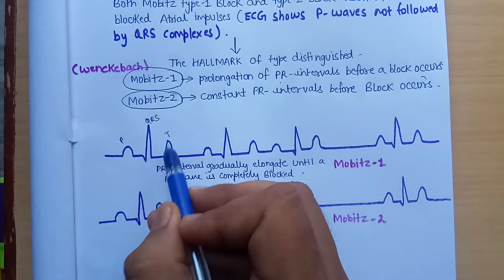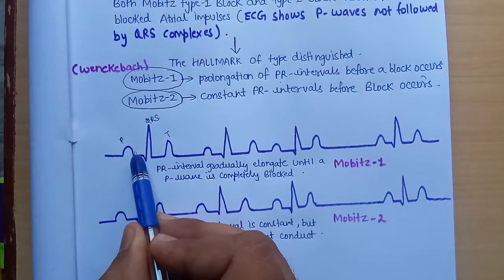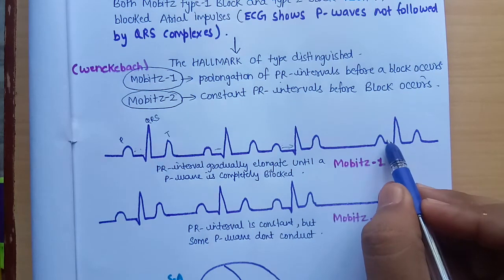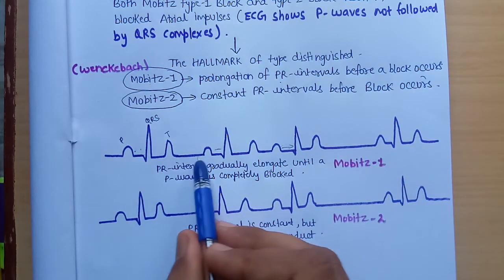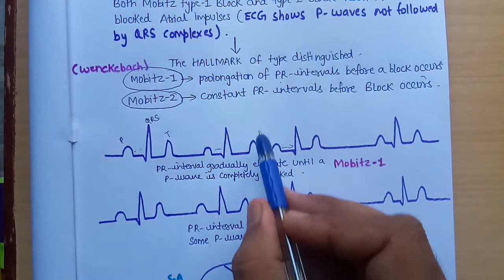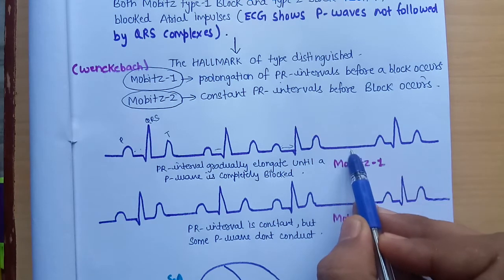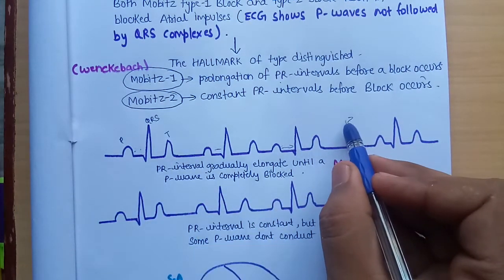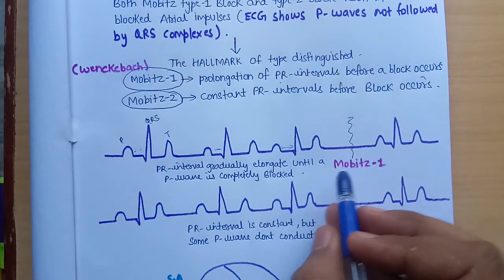All the complexes are quite normal here, but see — this PR interval here, and this PR interval here, and suddenly the QRS complex disappears. We see the gradual elongation of the PR interval, and suddenly the P wave is completely blocked — the impulse is not conducting to the ventricle. The QRS complex suddenly disappears after elongation of the PR interval, which is the characteristic finding of Mobitz type 1.